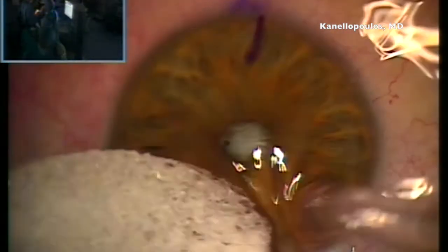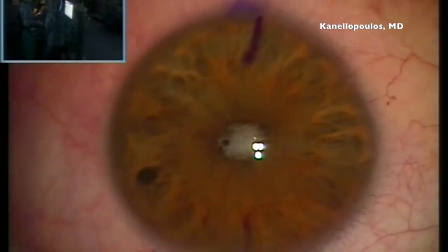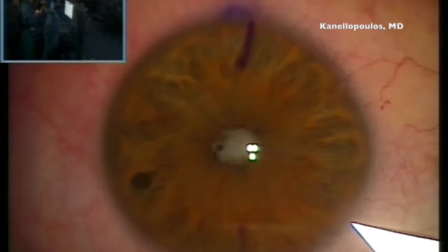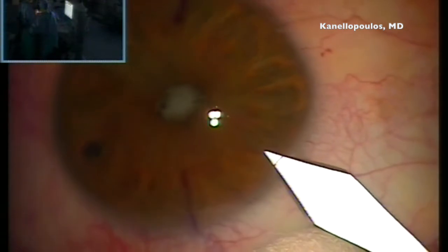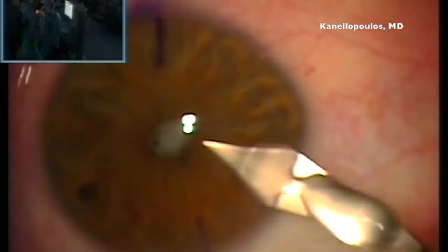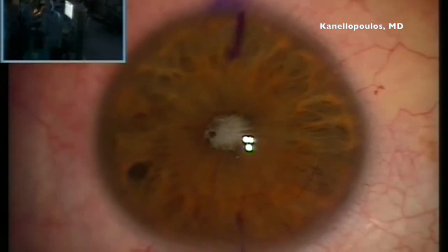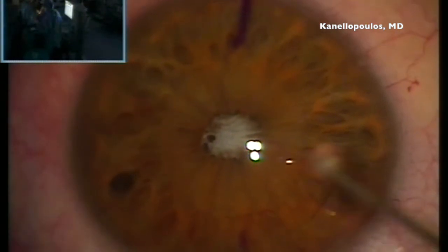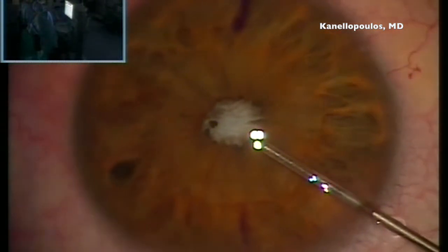The reason I'm showing this case, besides how to deal with a cataract of this form, and we'll see the technical intricacies that come up with the procedure, is also that it's a nice means of using a pupil dilatator such as the brilliant Malyugin ring. Boris has contributed immensely on this aspect in anterior segment cataract surgery. I think currently it's the international standard as the easiest to use in-and-out ring to obtain good pupillary dilatation during the procedure and have a safe cataract extraction.